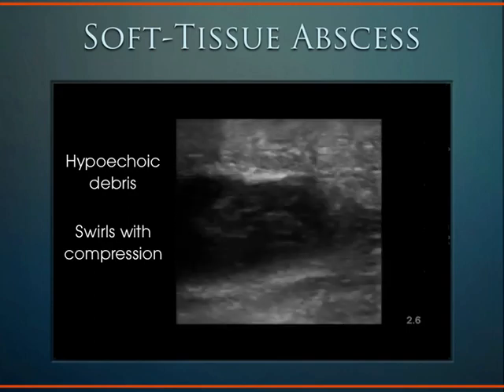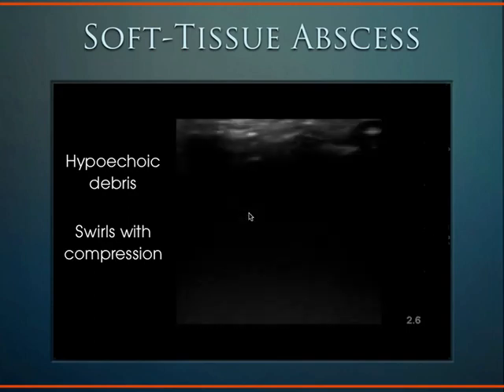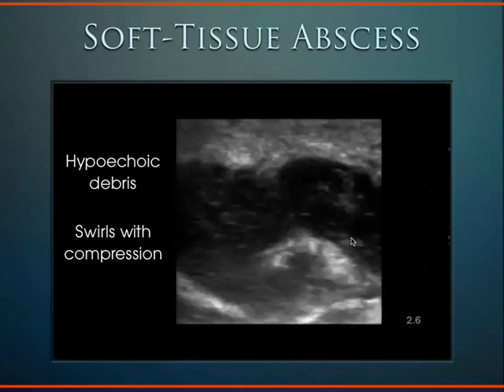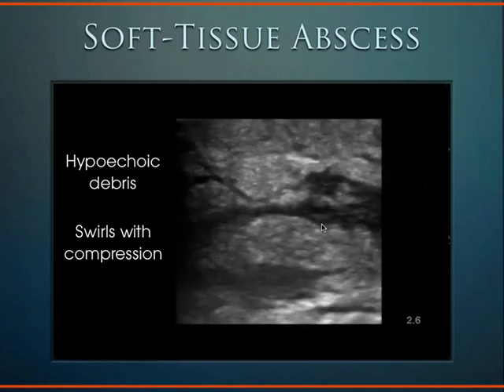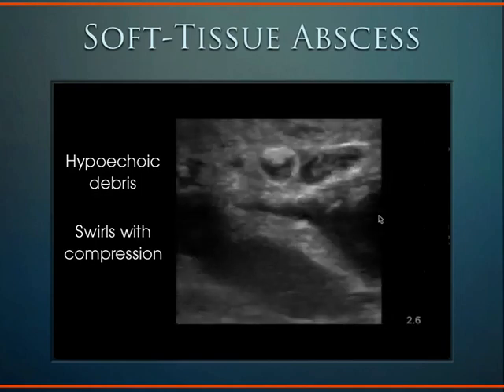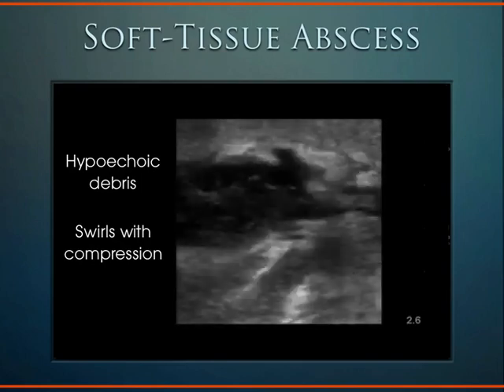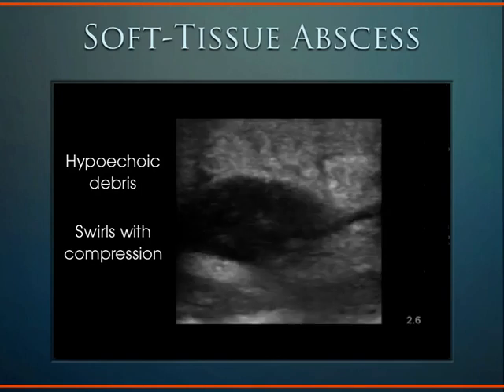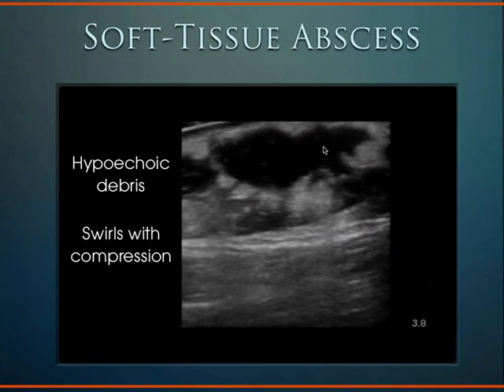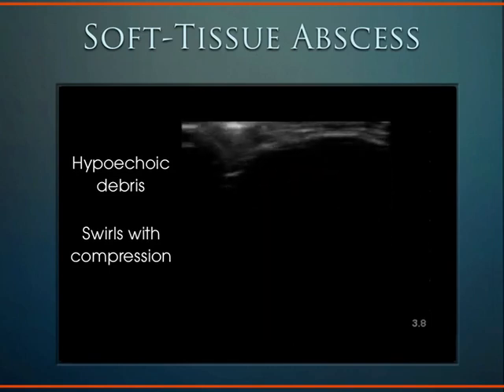Here's another example here of an abscess in this subcutaneous soft tissue. We can see once we line it up here, we're looking for it. Here it is. We see this debris here. And so many times you see sort of some cobblestoning, but then underneath it you'll see abscess. And other times you'll just see abscess without any subcutaneous soft tissue cobblestoning. Lots of examples of these. These come in all the time. We can see another example here of abscess material in that superficial soft tissue.